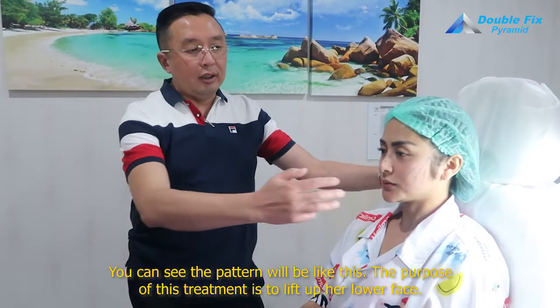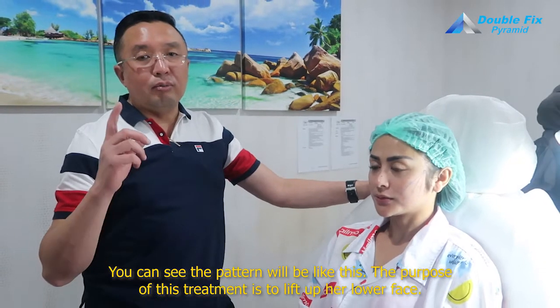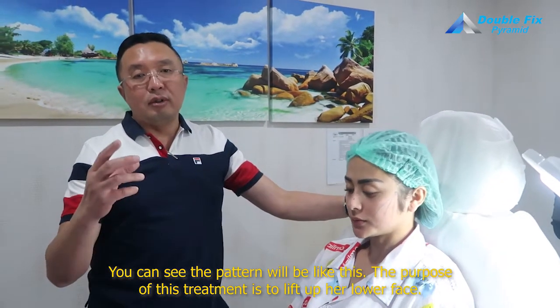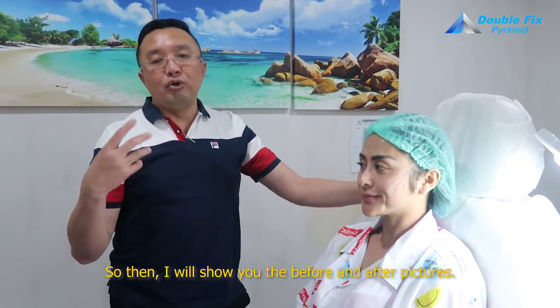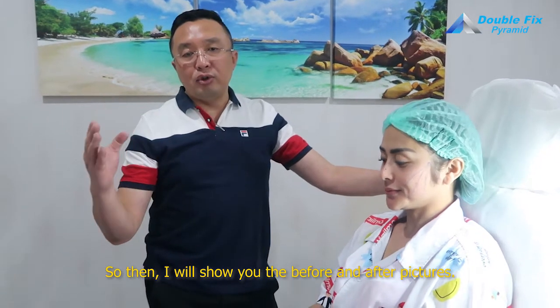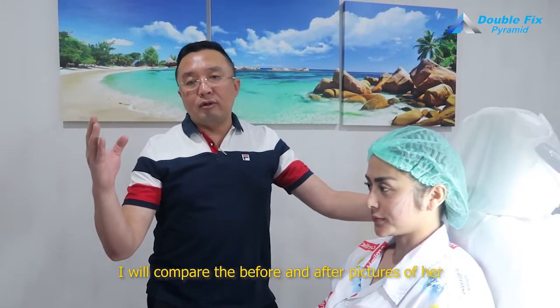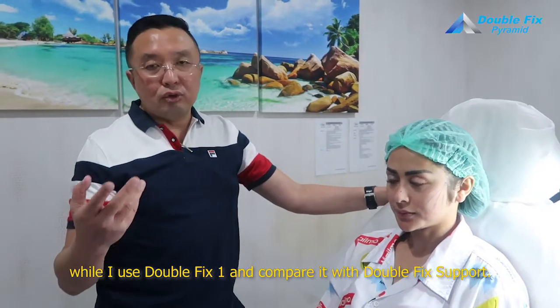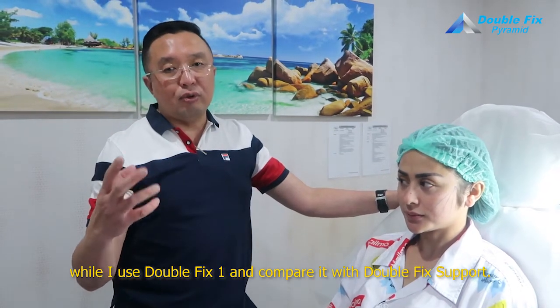You can see the pattern will be like this. The purpose is also to lift up her lower face. I will show you the before-and-after pictures. I will compare before-and-after pictures while I use Double Fix One, and compare it with Double Fix Support.